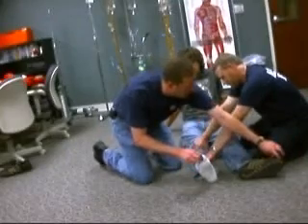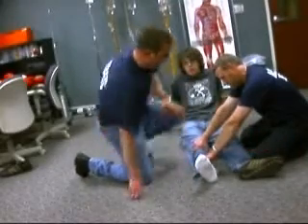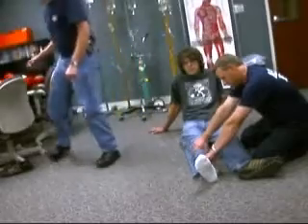Checking bilateral SMCs — pulses confirmed. Can you feel this? Can you move it? Yes. I'm now going to assemble my equipment.